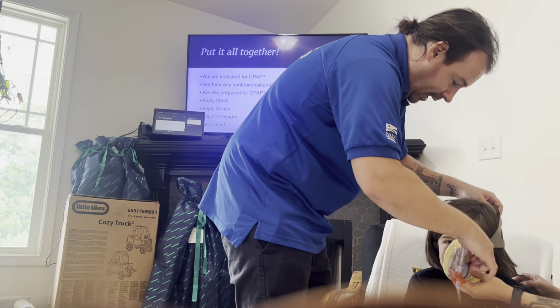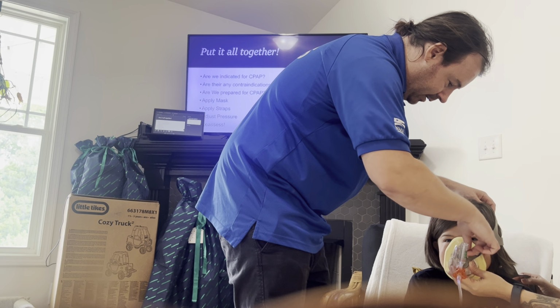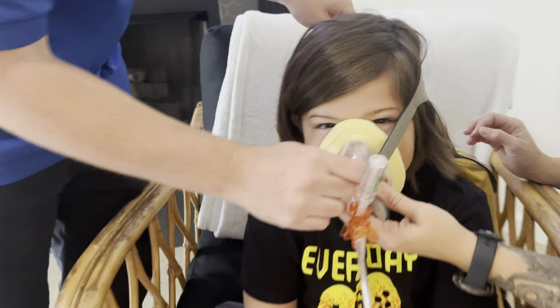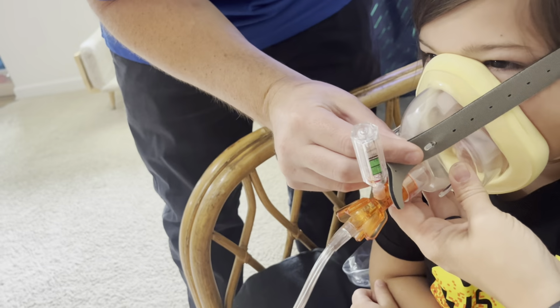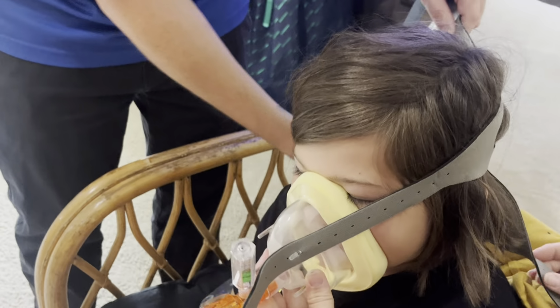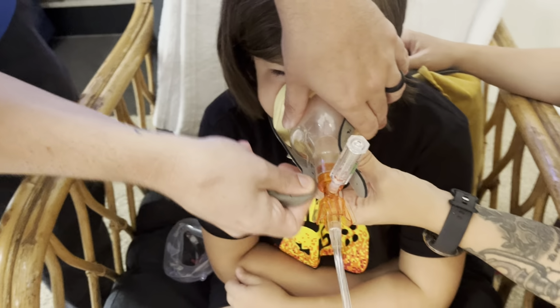So we go ahead and we'll start with the top right. And all you need to do is go ahead and you'll see here that there's little hooks on the mask. And we're going to put the whole of the strap through the hook. Now we're going to come around and go on the other side, diagonal to what we've got here, working around my wife's hand, right?